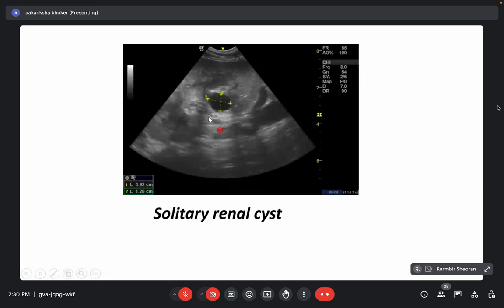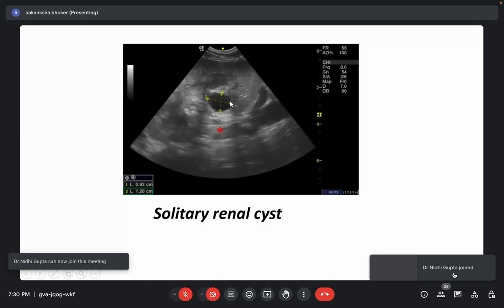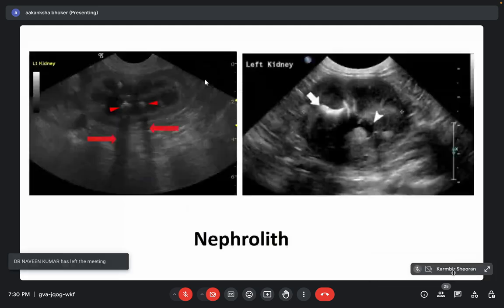So on sonography, we can get a presumptive idea that it is a renal cyst, but it can be an abscess also. For confirmation, we can correlate it with the leukocyte count. If there is a deep cavity abscess, then it is associated with high TLC and high neutrophil counts, and a cyst will not have such changes. Or we can take a biopsy to confirm. But this gross anechoic appearance with a clear wall is generally most predictive of a cyst.